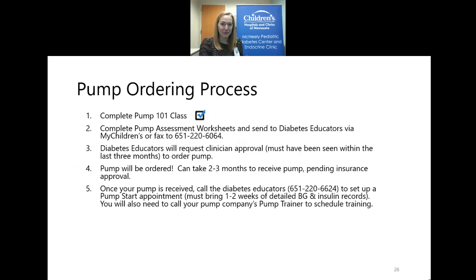Once you actually get your pump, we do need you to take a class with us called Pump Start. So you can either call us 651-220-6624 and just leave a voicemail saying you want to schedule your pump start. At that class, we will review blood sugars and doses to determine what your pump settings are to start. So it is really important at your pump start appointment to bring 1 to 2 weeks of detailed blood sugar and insulin records so that we can make an educated calculation of your doses.